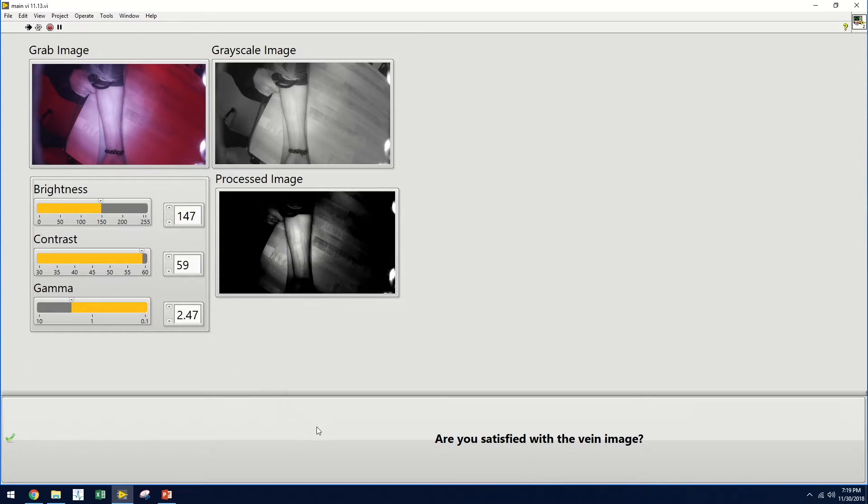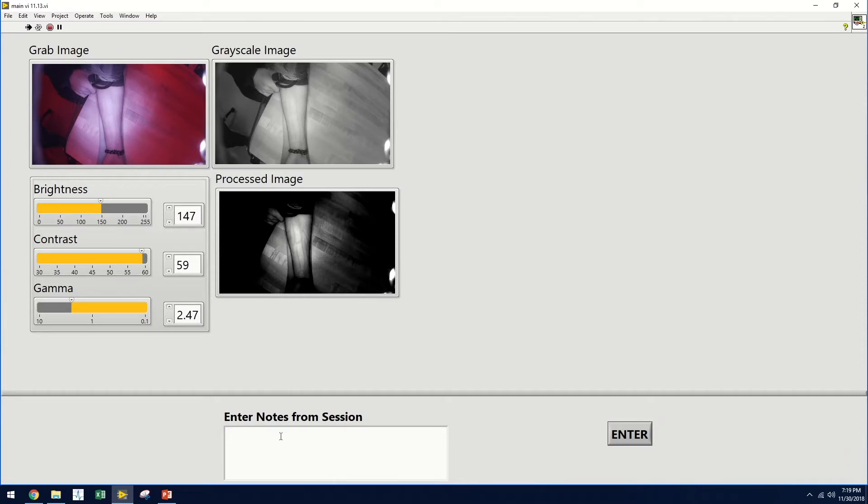Once they are satisfied, they can click the button at the bottom half of the screen, and it will save the image to the patient profile. They can additionally enter any notes that they have from the session, which will also save to the patient profile. Once they hit enter, the program will end.